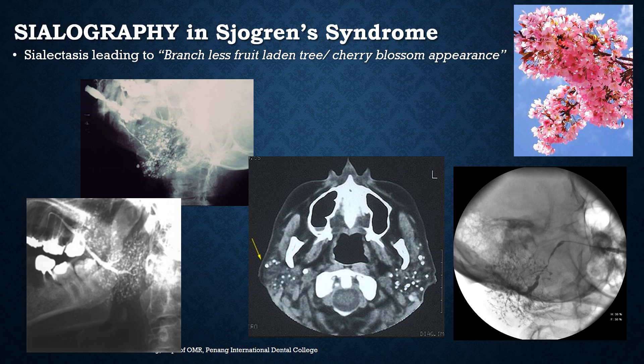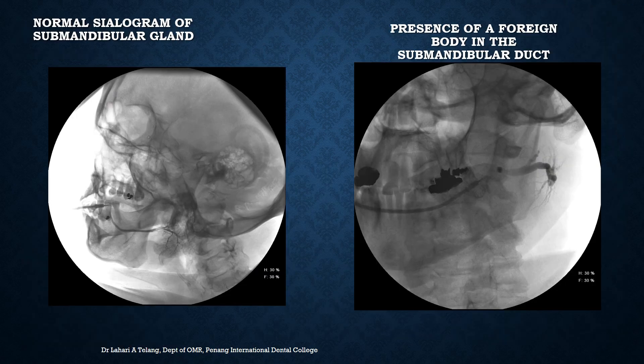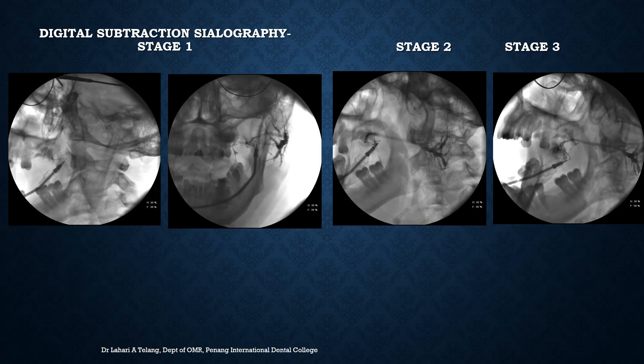After injecting the dye, various methods of imaging can be performed to view the effects of the dye in the ductal system. The normal appearance on a sialogram of the submandibular salivary gland shows the leafless tree appearance — the duct, its entire ductal system, and branches. When digital subtraction sialography is performed, you can observe the stages of dye slowly filling and then completely filling the ductal system.